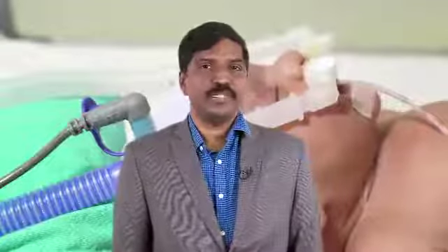The pressure built in the T-piece is proportional to the degree of obstruction or to the flow of gases in the closed T-piece. The obstruction to gas flow in the T-piece can also be achieved by immersing one end of the T-piece in a chamber of water. The pressure generated in the T-piece and in the lung is equal to the depth of immersion of the end of the T-piece. The greater the depth of immersion, greater is the pressure built in the T-piece.